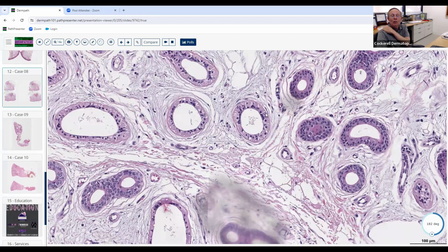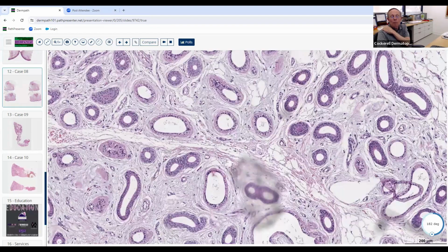And here you've got the clear cells with glycogen that are metabolically active, trying to reabsorb all the ions. So these are ATP actively functioning cells. These are probably more of the sustentacular cells lining the eccrine gland a little higher up. So basically, a nice example of eccrine.